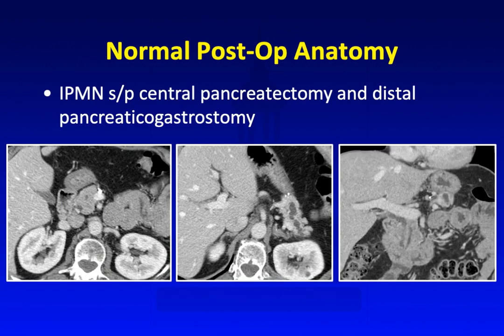Here's an example of a normal central pancreatectomy in which you can see the normal-looking pancreatic head. The pancreatic tail is now hooked up onto the stomach with a pancreaticogastrostomy, and you still have some dilatation of the pancreatic duct within the tail.